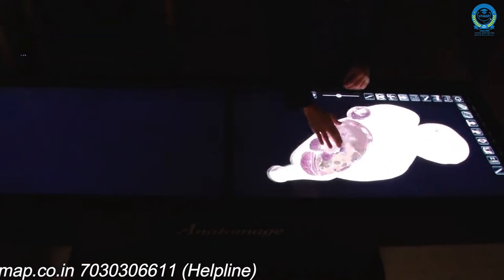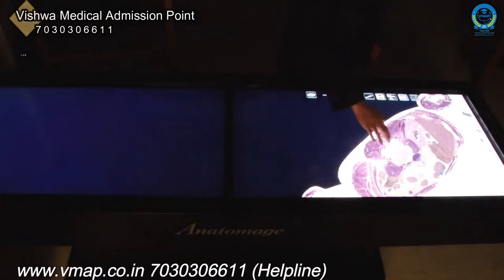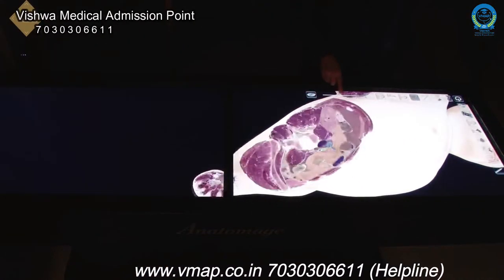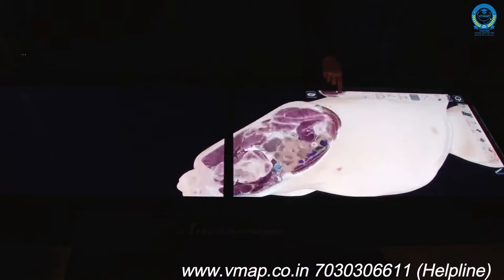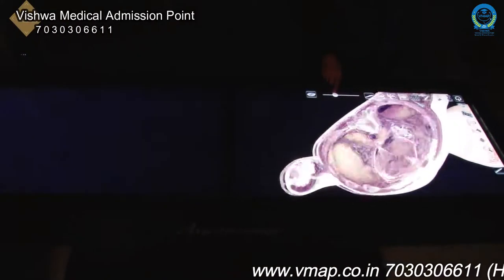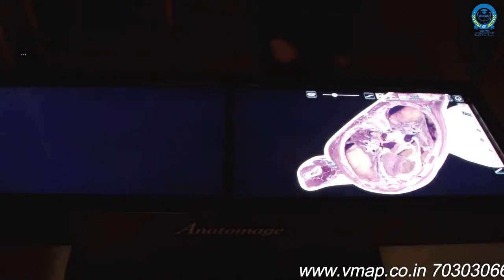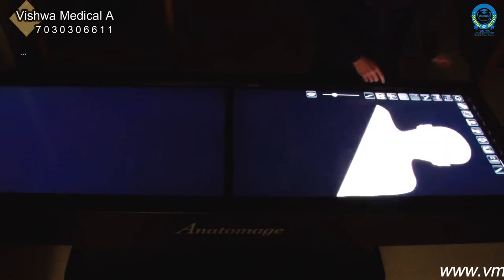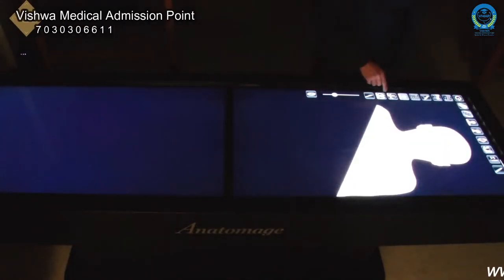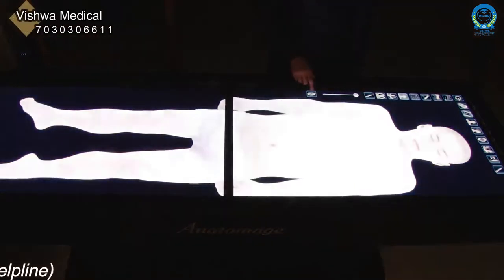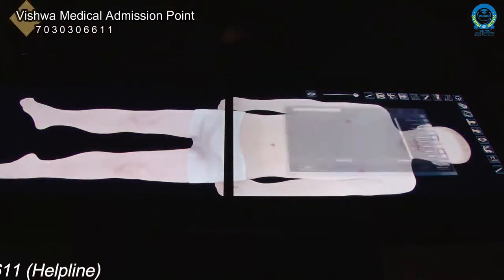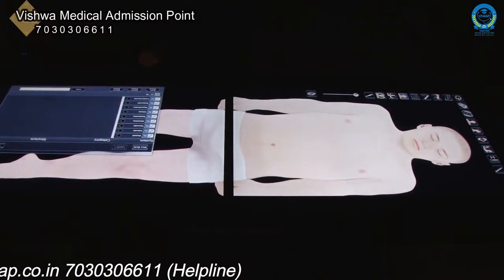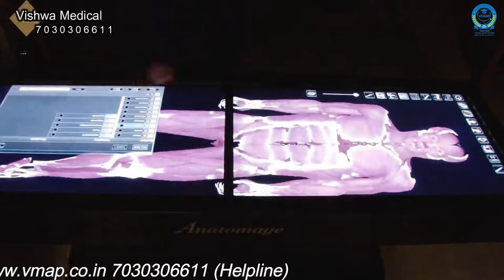Students are able to enlarge structures to better visualize them, remove tissues, and isolate body systems. They are able to isolate individual structures, and they can self-test by simply pointing to a structure and asking the table what structure it is. They can also write on the table and locate or isolate individual body systems.